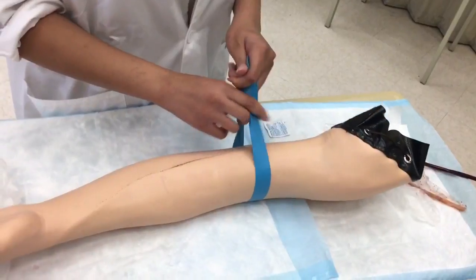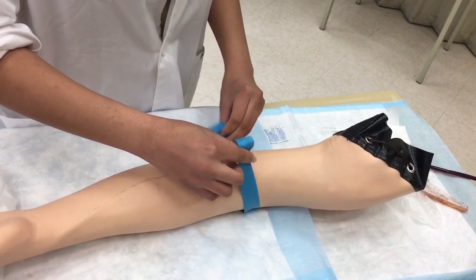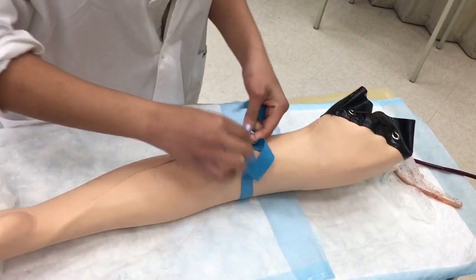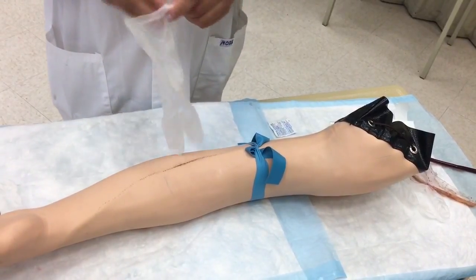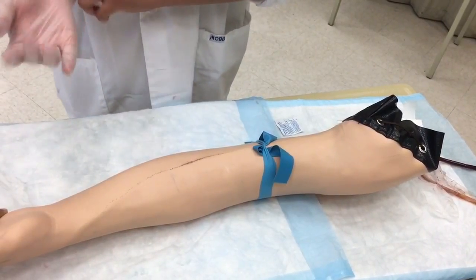Now I'm going to place my tourniquet about three to four inches above where I'm going to insert the needle. I tie my tourniquet like this — nothing too complicated — and then I can put on my gloves.